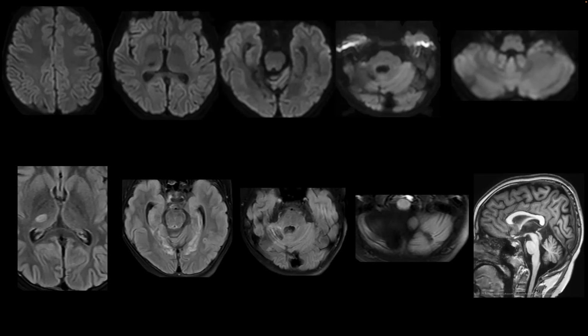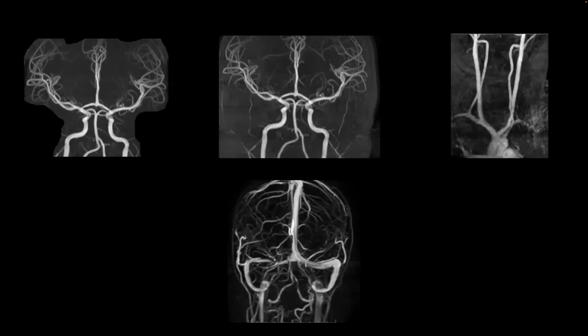Was a CT done by any chance, anytime? No, sir. CT was not done. The other doubt we had was, could it be vasculitis in this child? Okay, so this is the most recent angio, and there is no beaded appearance, at least on the angiography, no irregularity along the walls. So since there's no acute stroke, I wouldn't expect any new abnormalities.